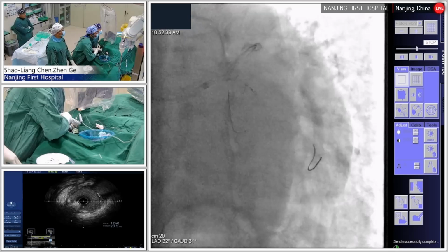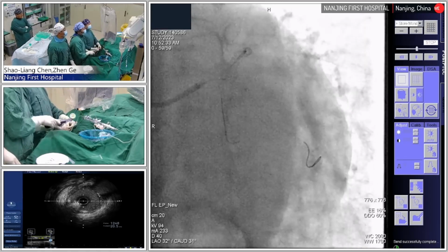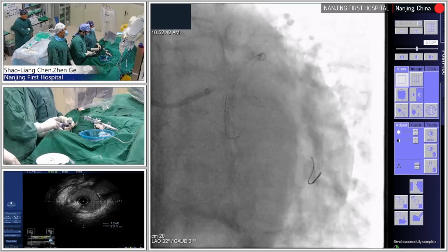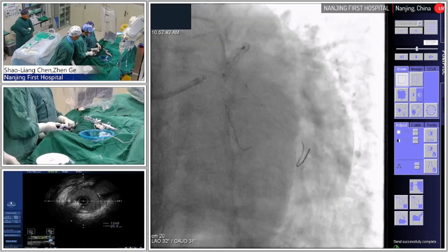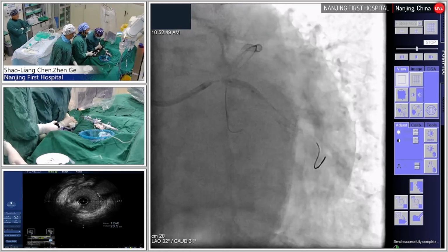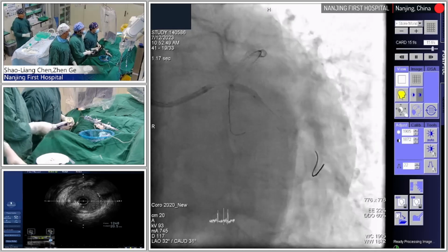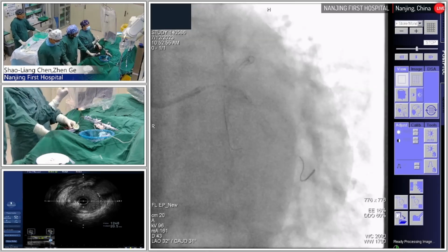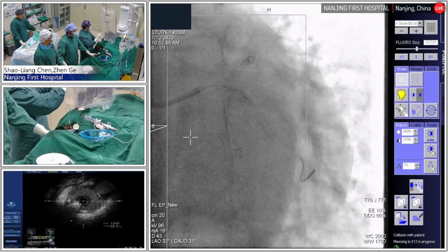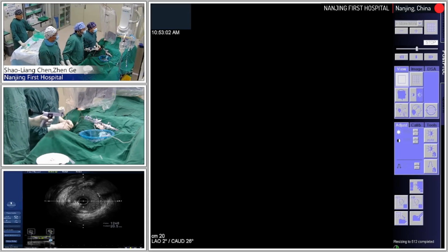Here, okay. Good. Great. So can you move to the proximal? Because the anchor is central, back, proximal segment to the bifurcation area.